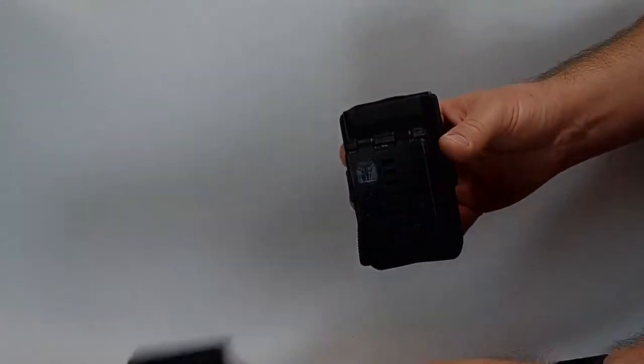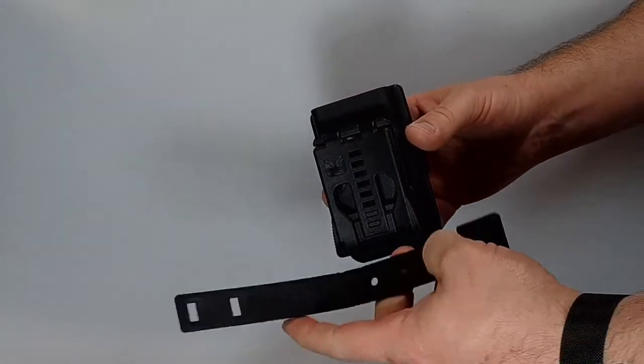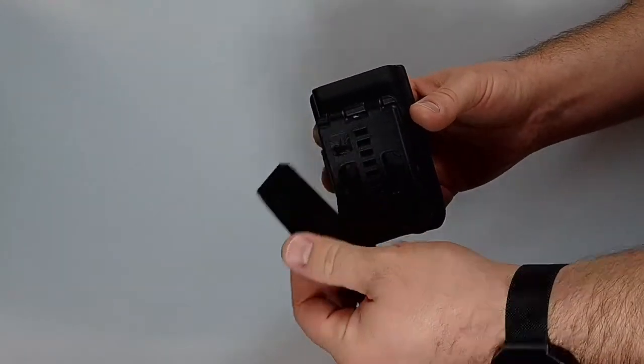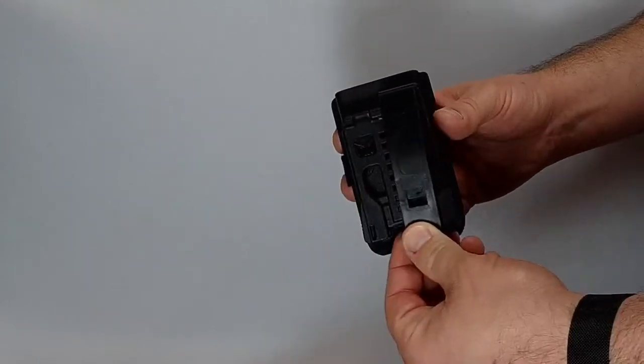We can also use a flexible malice clip which would also work for duty belts or MOLLE type gear, and there would be one on each side of this to lock it in.